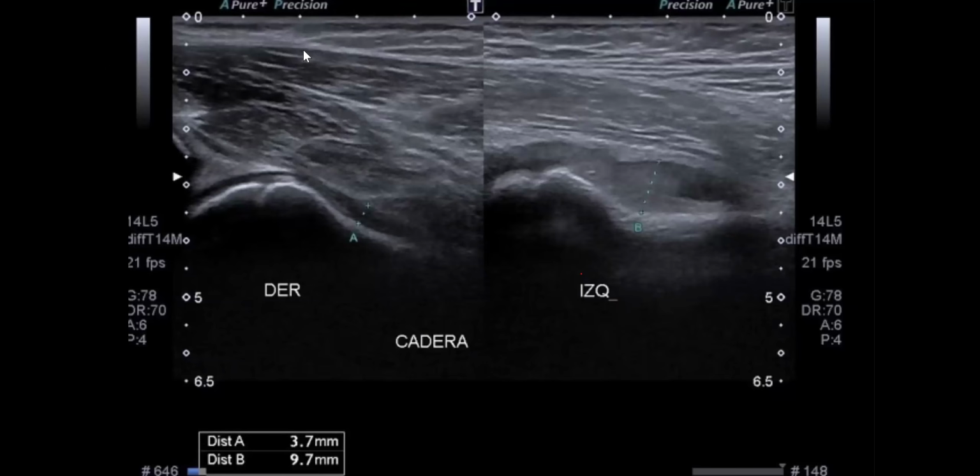Let's see, an 8-year-old with hip pain, complaining from the left. This is one of the ultrasound images of the hip joint. I can see there is widening of the anterior recess of the hip joint, indicating joint effusion on the left side. Clear or turbid? Sir, it's turbid. It has subtle ground glass echoes, likely infective, indicating likely septic arthritis.